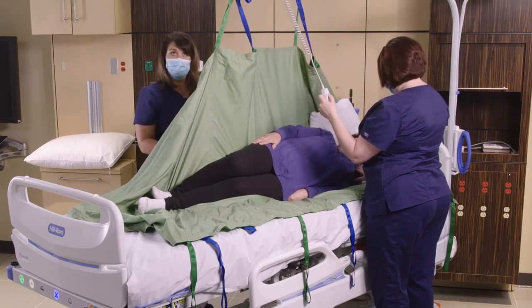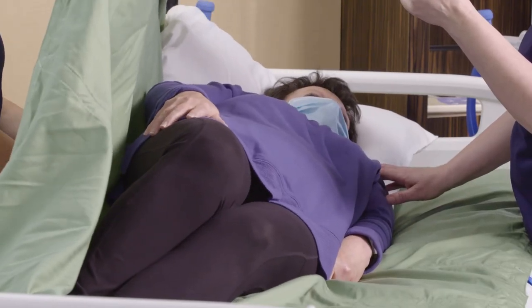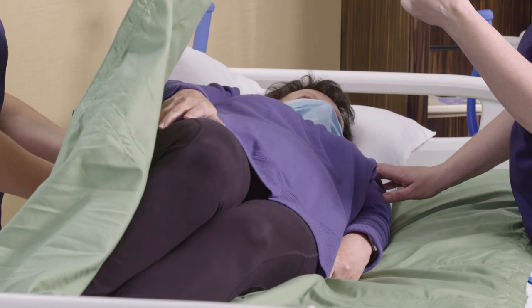When our wedges and pillows are in place, we can go ahead and lower the sling back down, and the patient will remain in a turned position with those wedges and pillows.